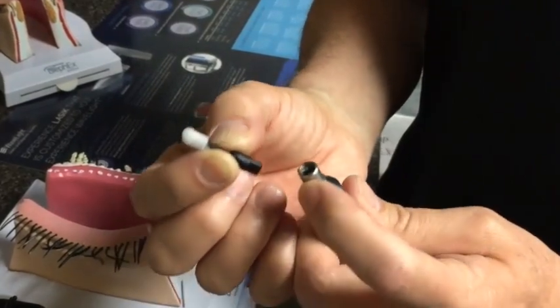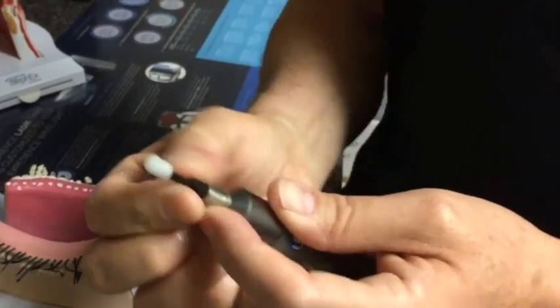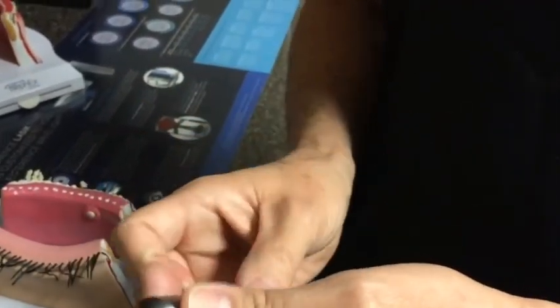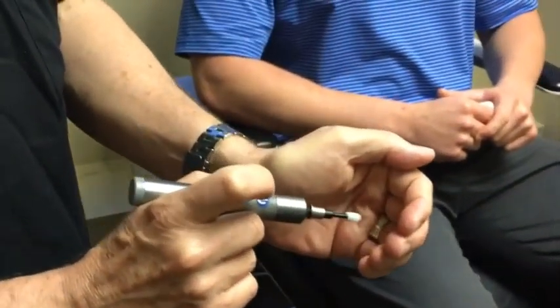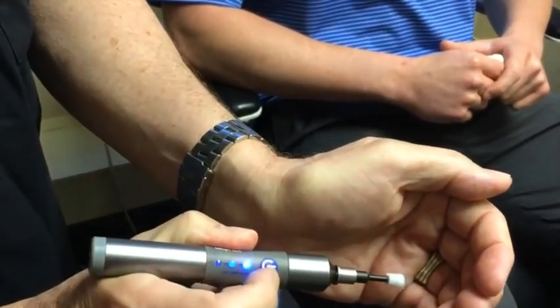Use your finger here to sort of manipulate this and get this lined up, and then it just shoves straight in. So it's a nice pressure fit. Now push hard so you really know it's seated down very, very well. Then I switch hands. I shield the patient, and I hold the power button down for 2 seconds. So 1, 2, and now it's on.